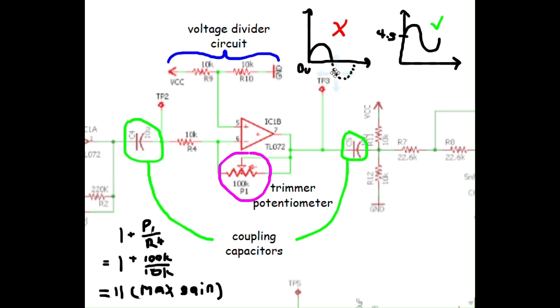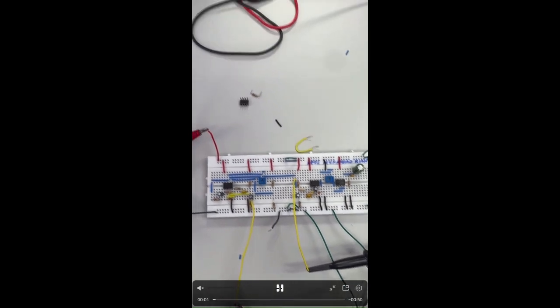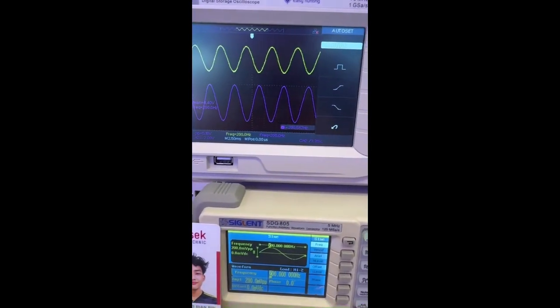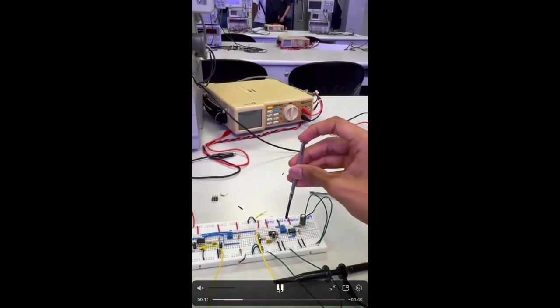Since it is a non-inverting amplifier, we use this formula to determine the gain. Assuming the trimmer is at its max resistance, this is the max possible gain we could get from this amplifier. This is me measuring my TP3 in my own circuit. So this is the waveform shown at the oscilloscope with a voltage peak to peak of 6.16 volts.